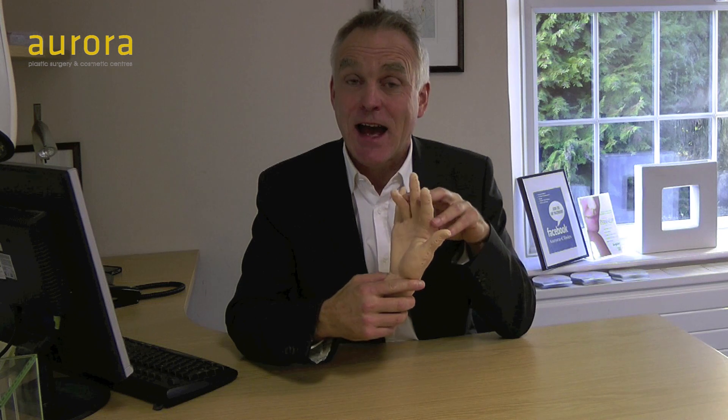The first one I'm going to be doing today is carpal tunnel syndrome. I couldn't unfortunately find anyone in the office who was happy to have their hand treated, so I've got a rubber hand here and I'm going to be showing you on the rubber hand how to inject the carpal tunnel.